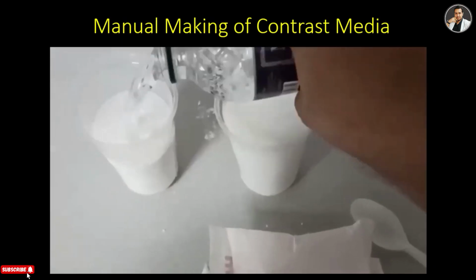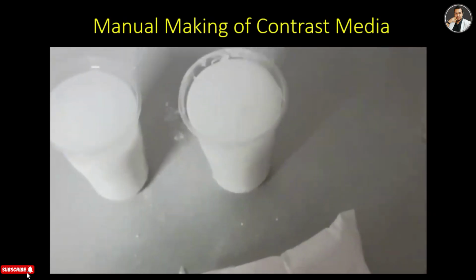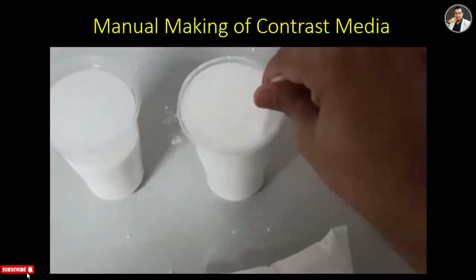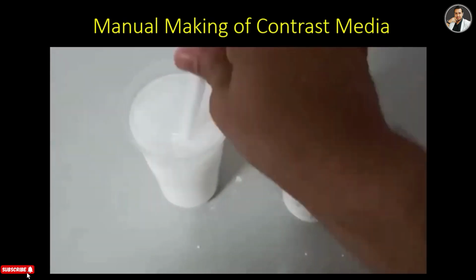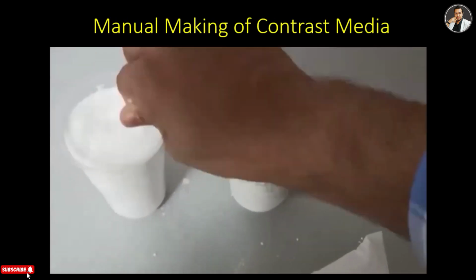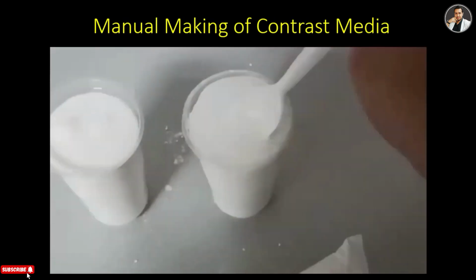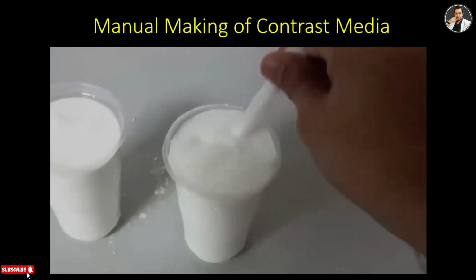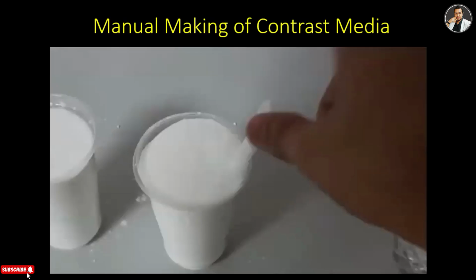Then fill the glasses with water, and stir it with the spoon so that the barium mixes with the water, and keep stirring. Barium is a water insoluble substance, but if you stir it properly, it will spread through the water, and it looks like milk, 2 glasses of milk. So that's the procedure.